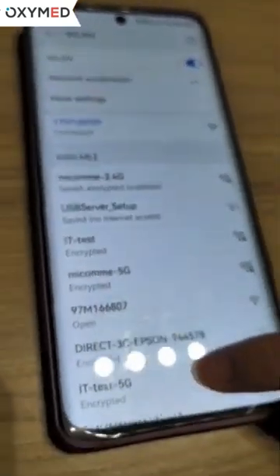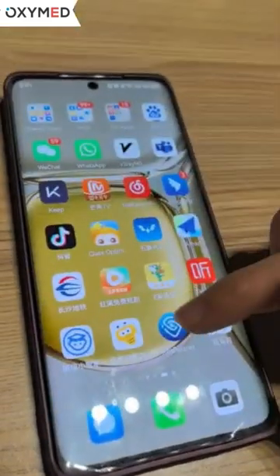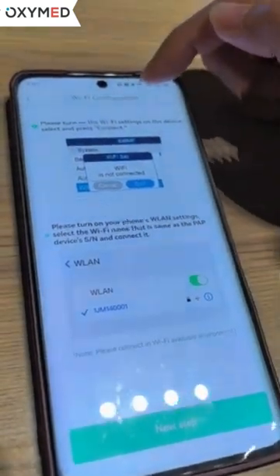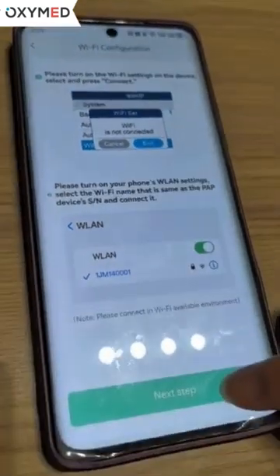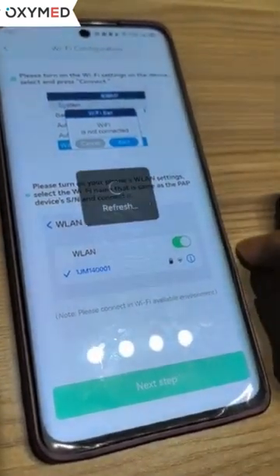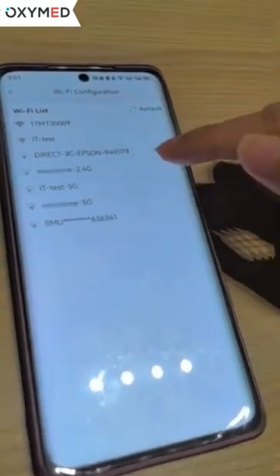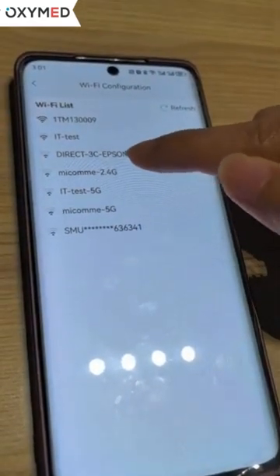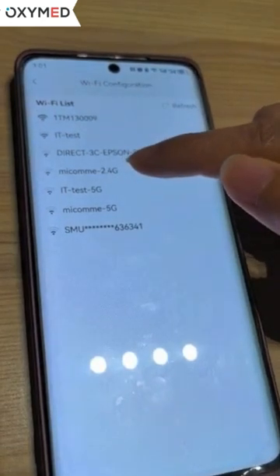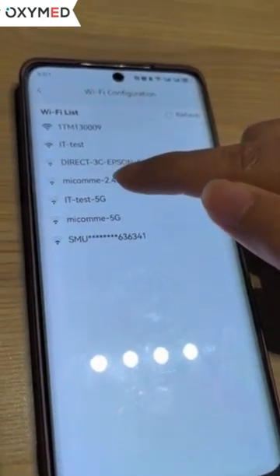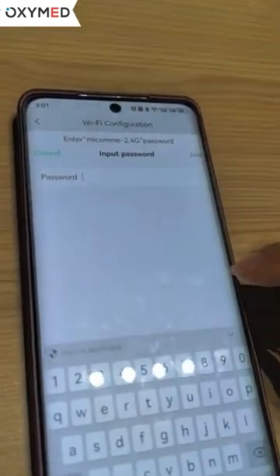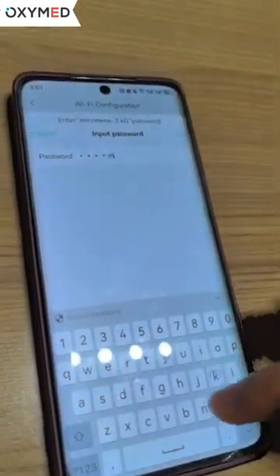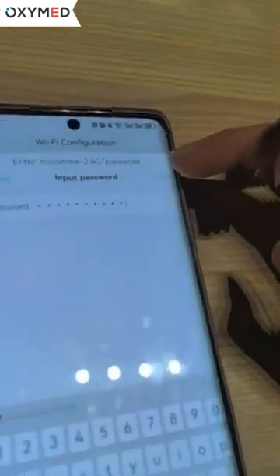Next, we exit the device Wi-Fi and return to the partner app. We enter the Wi-Fi configuration and click next step. We need to choose our home Wi-Fi — pay attention to select the 2.4GHz network. Then we enter our home Wi-Fi password and click join.